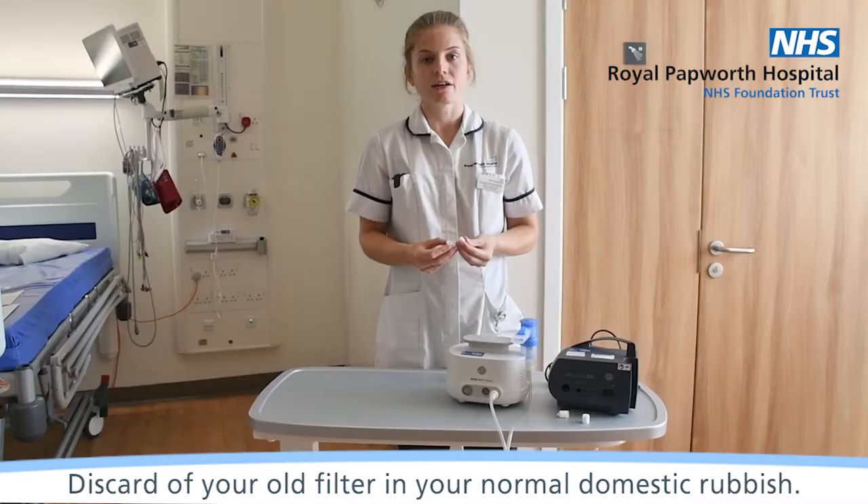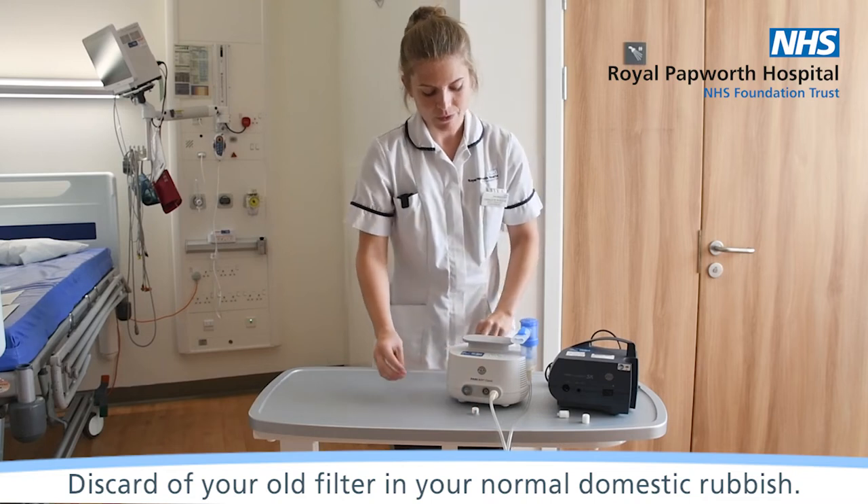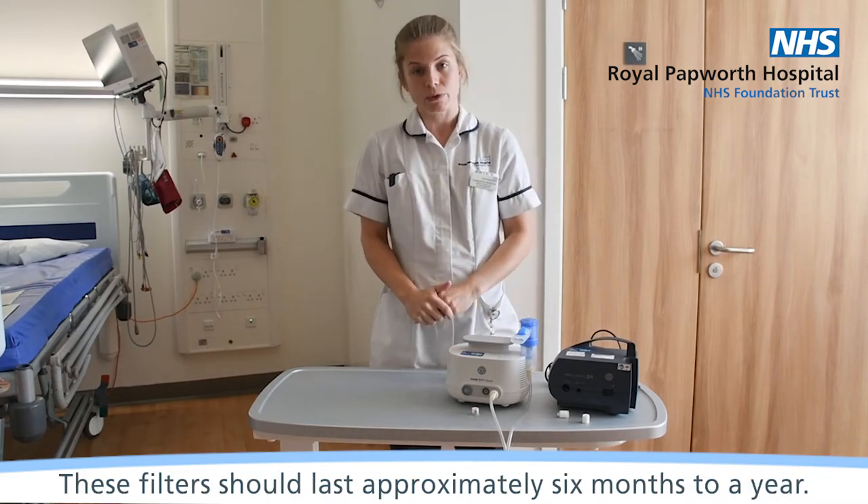Discard your old filter in your normal domestic rubbish. These filters should last approximately six months to a year.